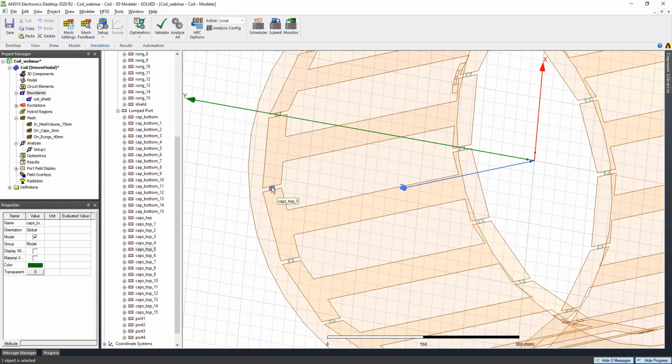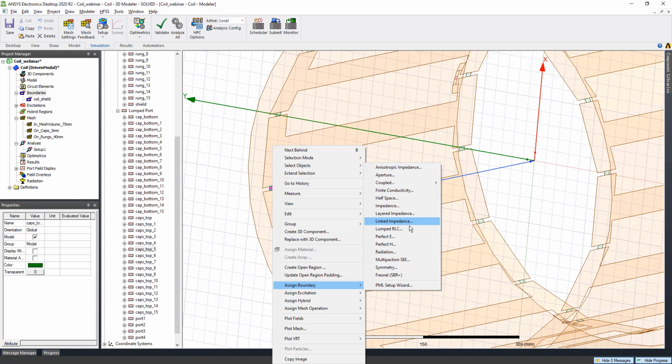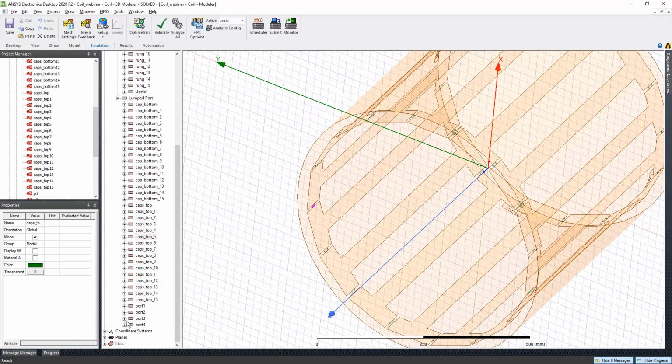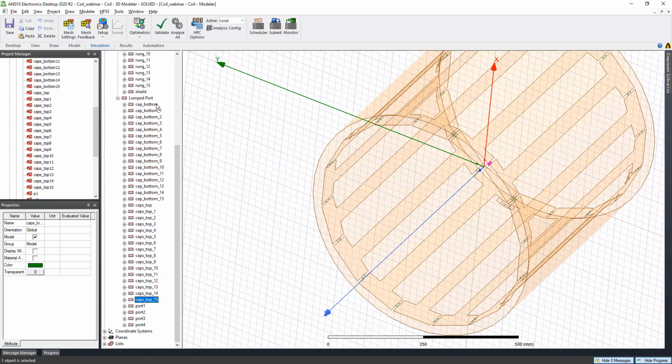But if your design is already optimized and you know your capacitor values, then you are always welcome to just set the values here. You can basically right click, assign boundaries, and then you can set the lumped RLC values for it. Here you can enter your capacitance value, resistance value, and inductance value. There are many ports, and we only have 4 ports that are our real excitation. You can see it's here, and all the other ones will be our tuning capacitors.